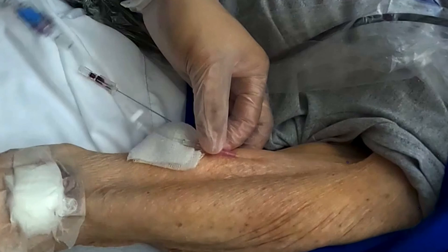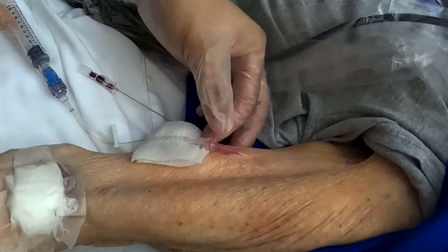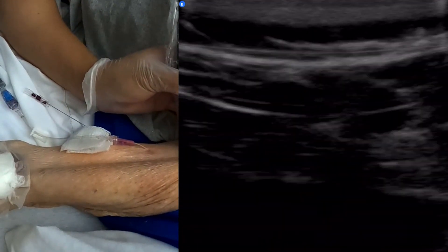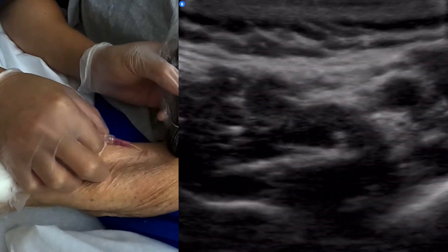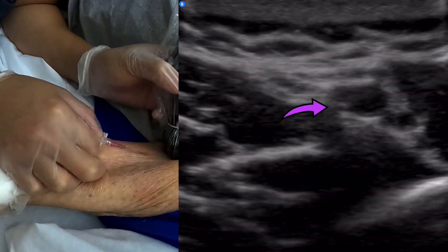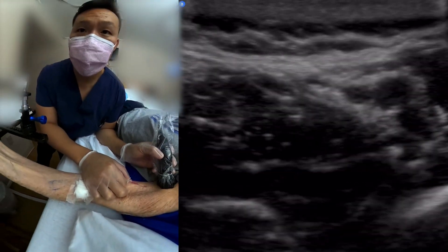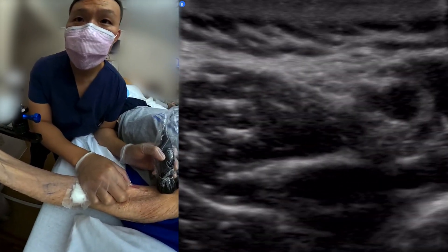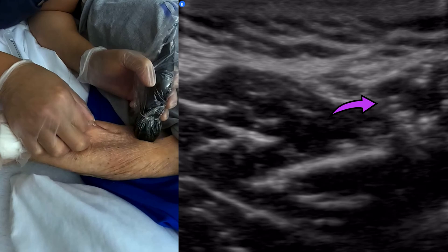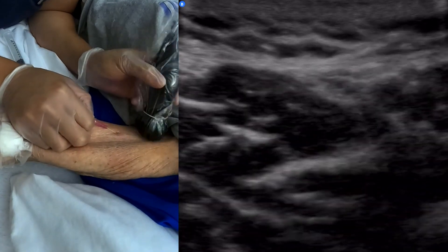There it is — good blood return, good flush. Let's see what happened there. Let's see where that catheter is lying. There's my catheter there — let's see what's happening here. All the way to the end. There's the catheter. There it is — there it is at the tip.